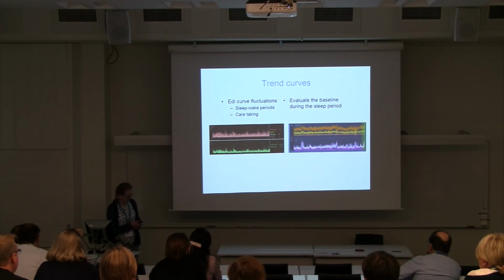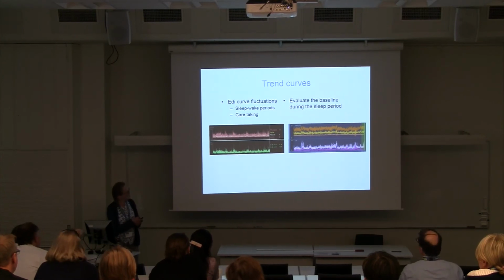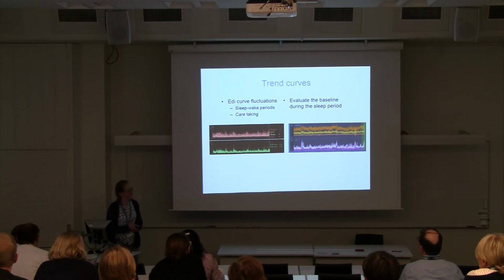And when we evaluate these, we should always find a place when the baby is asleep when we think of making any changes in the NAVA settings.